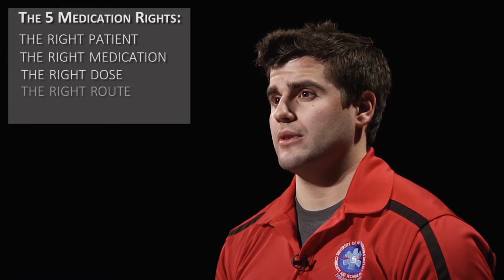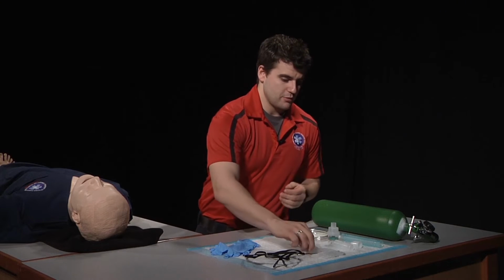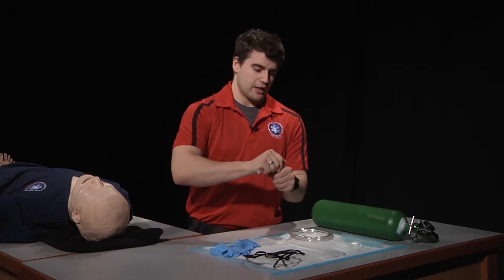Our 5 medication rights are our right patient, right medication, right dose, right route, and right time. We also want to check for clarity and a good expiration. Now it's time to assemble our nebulizing unit. First step is to put the medication inside of the medication cup.